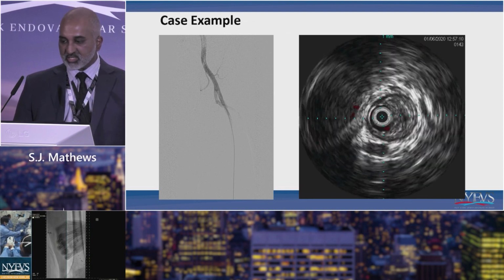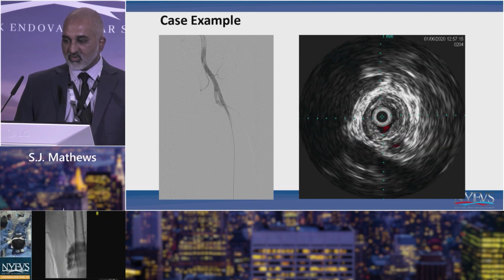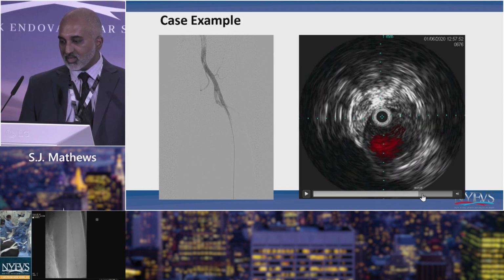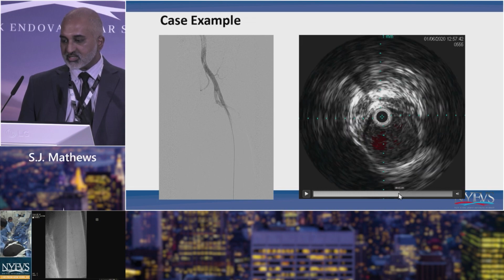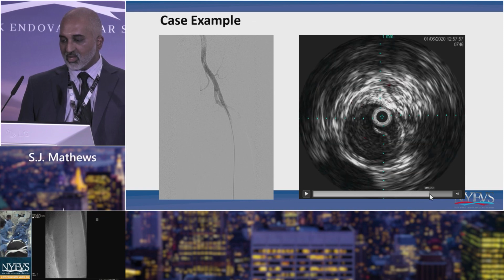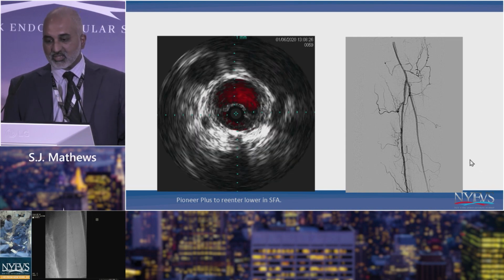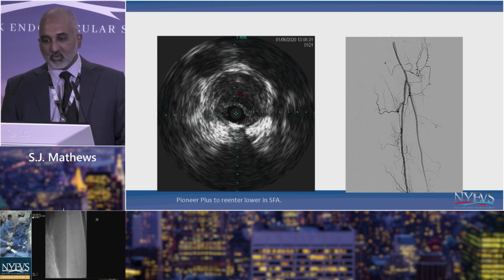So you can see this patient has extensive plaque. We're intraluminal as we crossed from below, but as we move up, and I'm going to skip ahead here, you can see that we end up in the subintimal plane. The reconstitution segment was in the mid SFA, and we ended up going a fairly long length subintimal until we re-entered. Unfortunately, I don't want to lose all of that patent SFA, so I used Pioneer with IVUS guidance to pop back into the true lumen within the mid SFA.